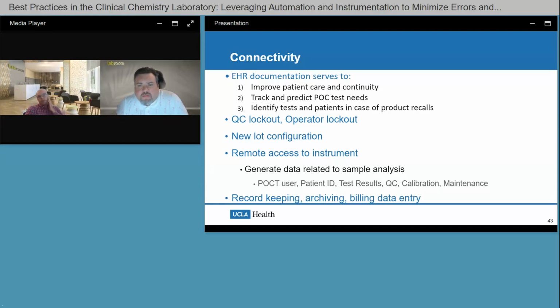Yeah, so when it comes to stat testing, where I see this most, Matt, is in the space of toxicology and therapeutic drug testing. Those are tests that require fast turnaround time, like, for example, our immunosuppressants, tacrolimus, everolimus. The doctors do want those same day, within a few hours of the patient being drawn, because they adjust dosing. I've also seen those requests in the toxicology space. A recent one was ethylene glycol, because they treat based on those results. These tests used to be sent out and came back after a few days. Obviously, at that point, it's good for confirmation to know if that was indeed the case based on the doctor's suspicion. But when it becomes really useful is to be able to treat based on that result. And so getting that within 1 hour, I think, has been helpful to our toxicology doctors.